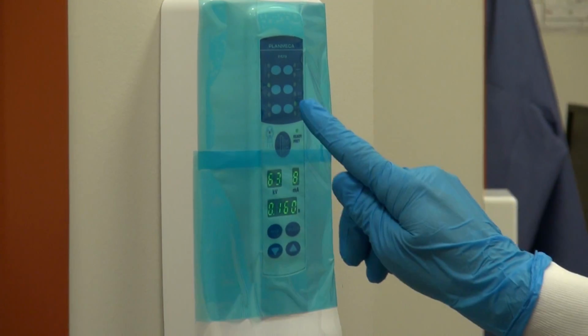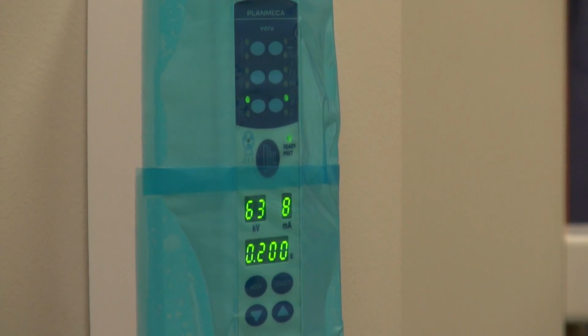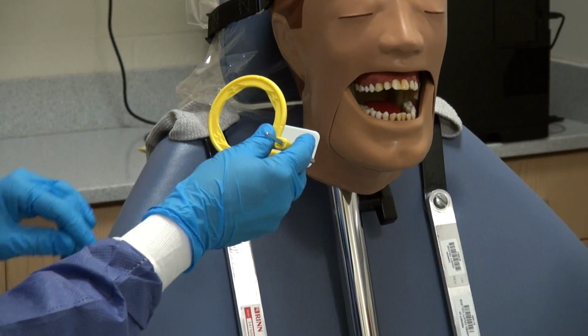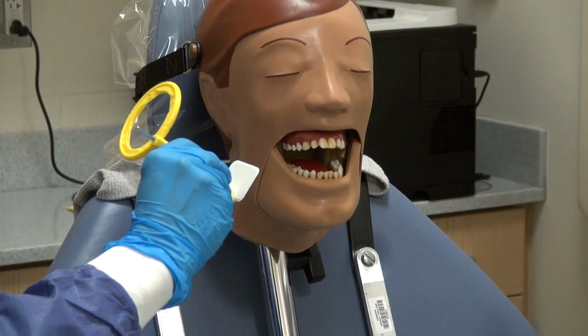Recalibrate at the control panel for the maxillary molar periapical. Again, center the film on the bite block, dot in the slot, and white is right. Pull the ring out slightly and hold the rod at the bend close to the bite block.